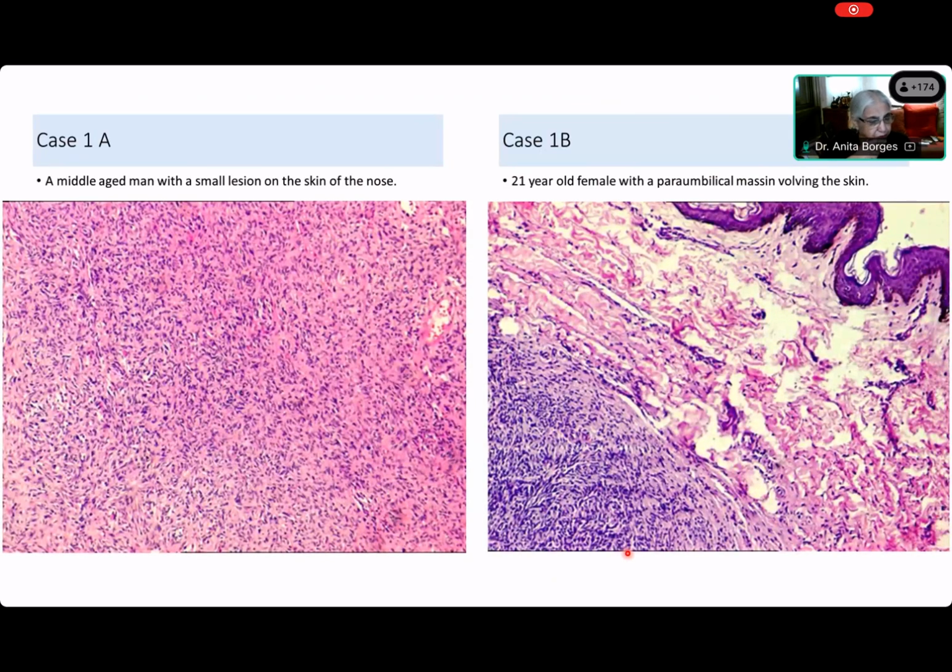All right, who wants to take the first case? I'll start with Saida because I've got a list of names and we can go one after the other. Come on, Saida, this is easy. There are two lesions and they look similar, right, Saida? Yes, ma'am.